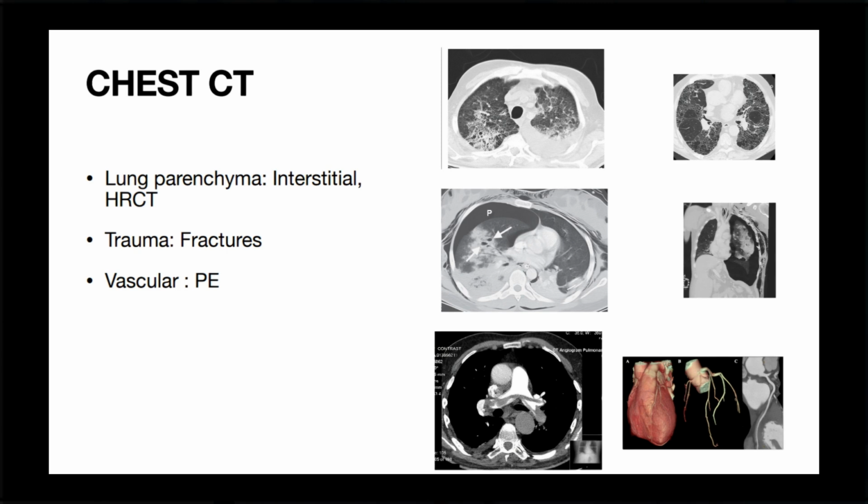Here in the lungs, we can use the high-resolution CT. Incidentally, many doctors do not appreciate the high-resolution CT. They tend to get this impression as though the high-resolution will show you more detail. Yet, we tend to use the high-resolution. So if you are a referring doctor, and you're not quite certain about it, you can even cross-check with us, ask with us. But high-resolution CT is usually for the lung parenchyma. We just dealt with COVID a few years ago, and then we are able to demonstrate it in the lung.